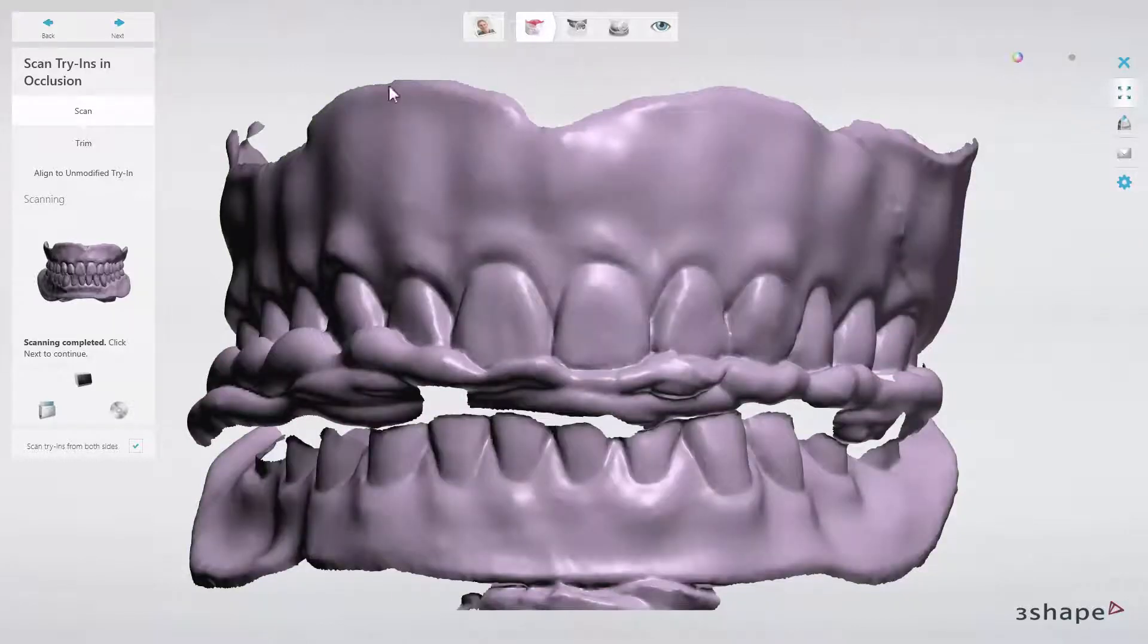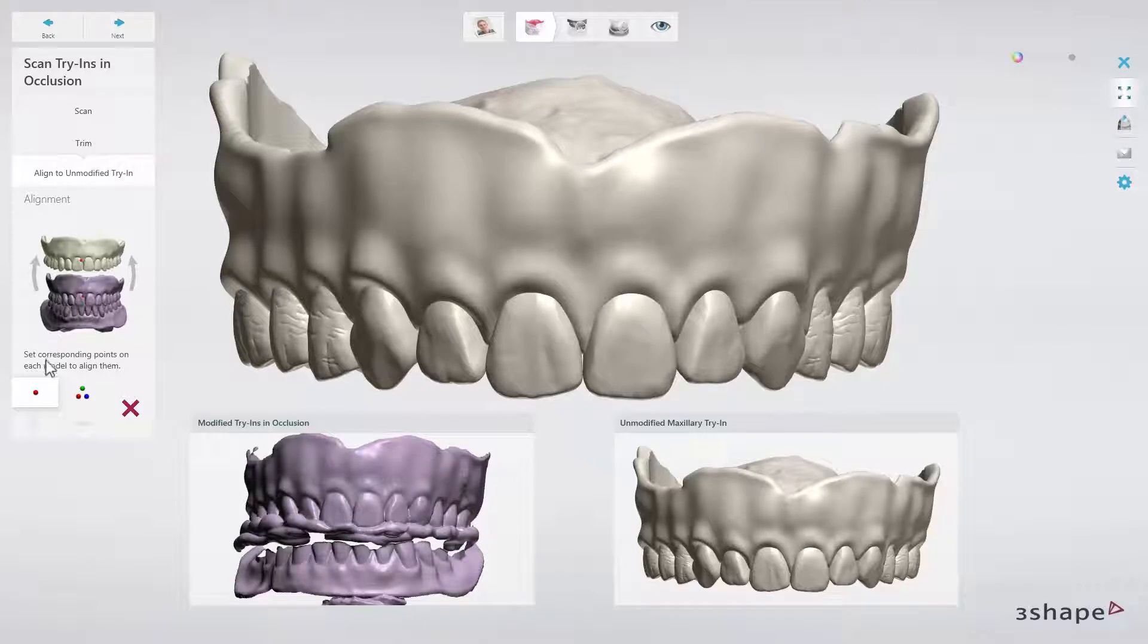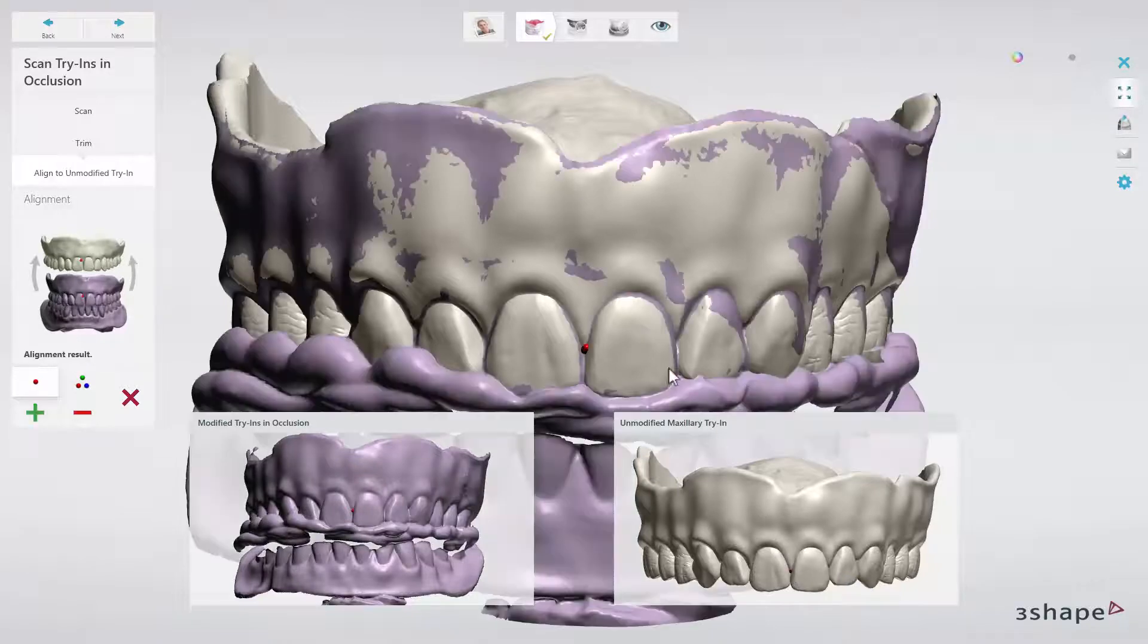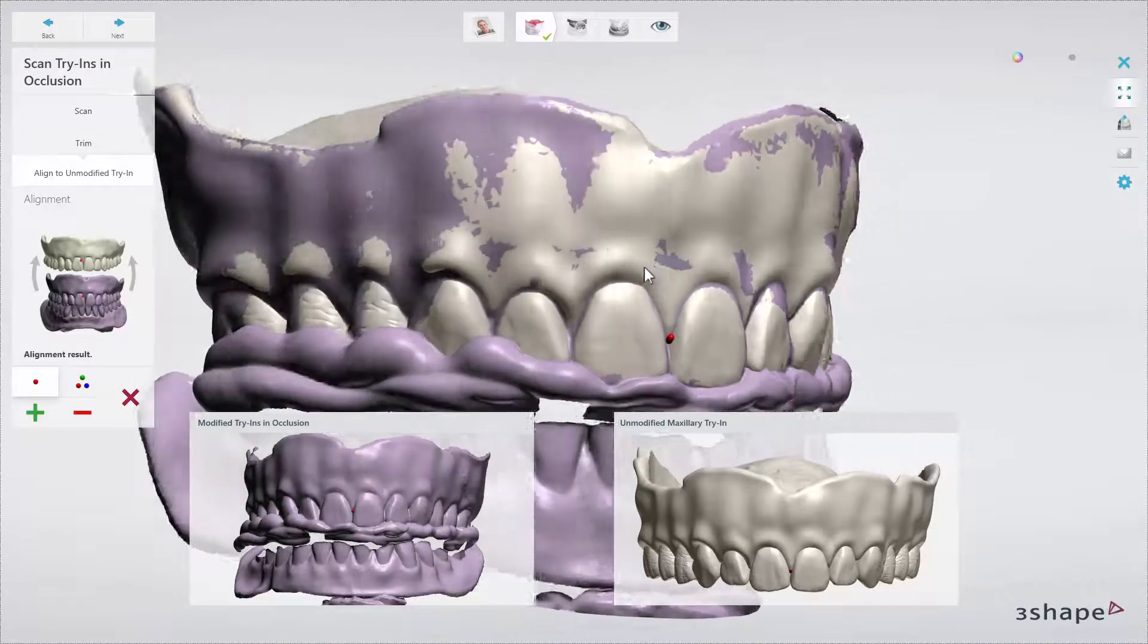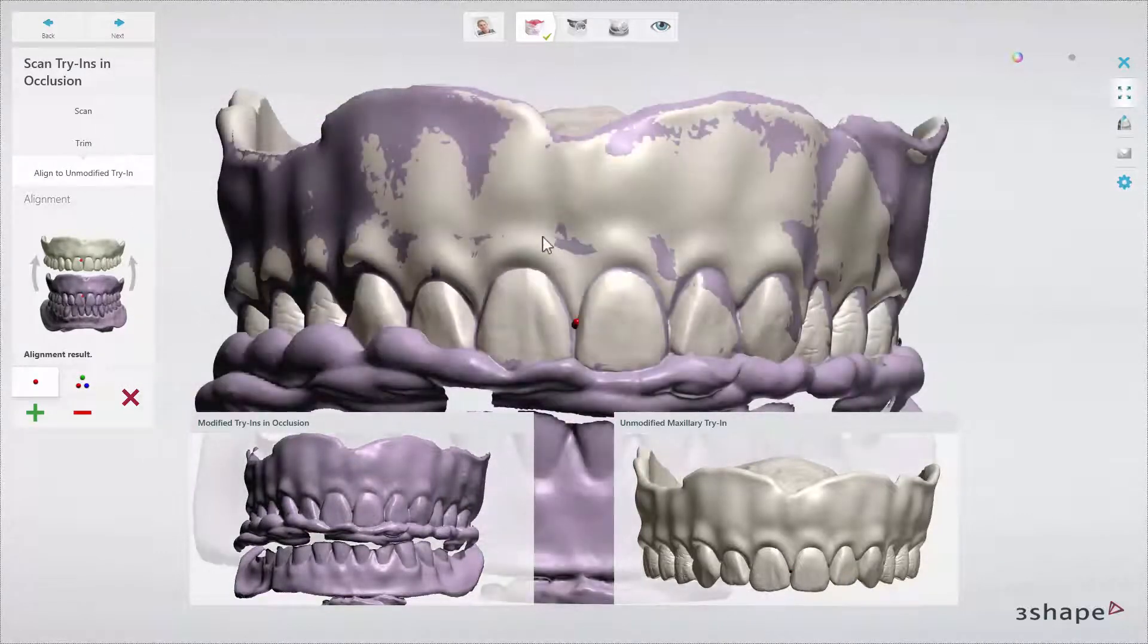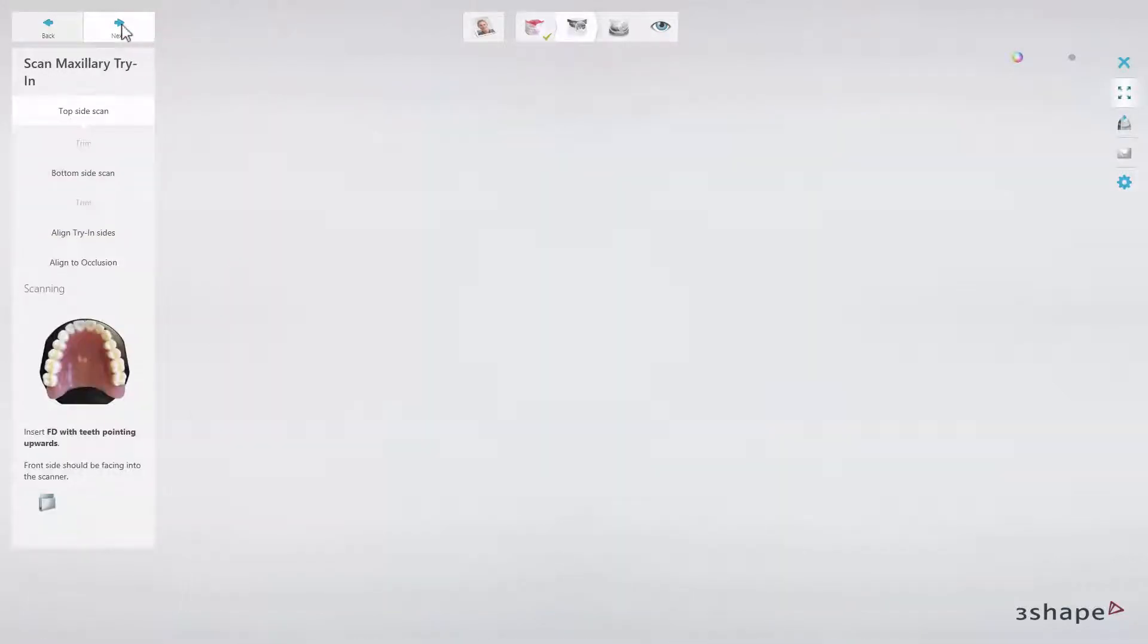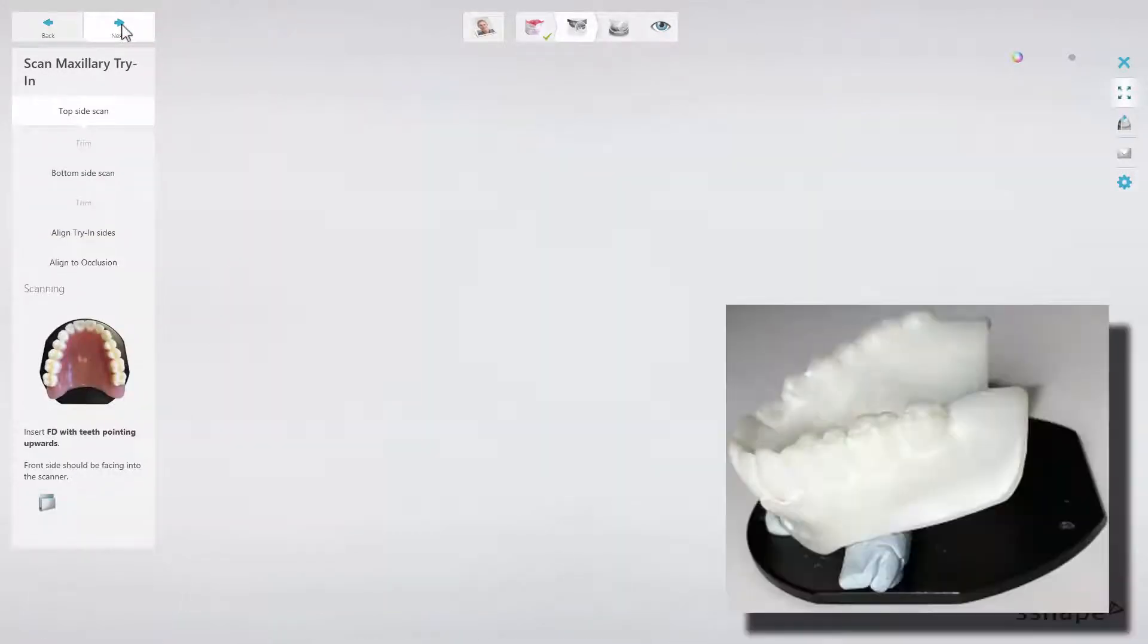When scanning is finished, align the upper unmodified try-in design to a new modified occlusion scan using one or three-point alignment. When ready, click next and go to the scan maxillary try-in step.